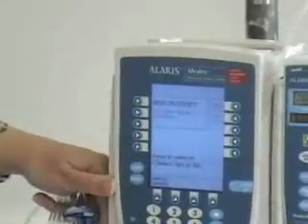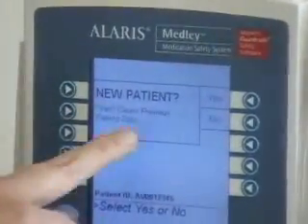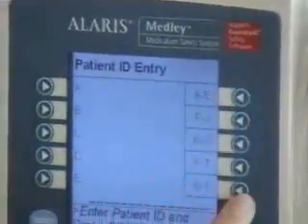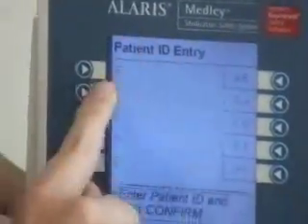The first thing the Alaris pump does is ask you: do you have a new patient? We're going to go ahead with yes. You select yes with these buttons on the side, and then the screen will let you know what to do.